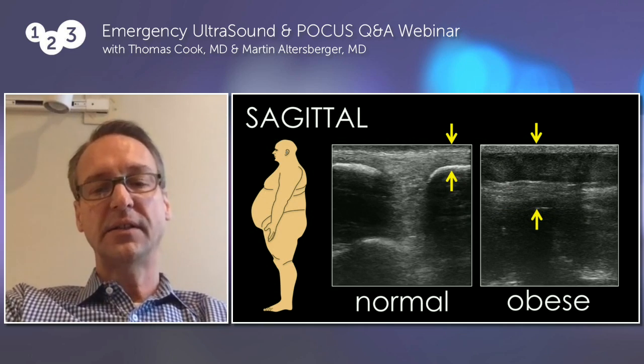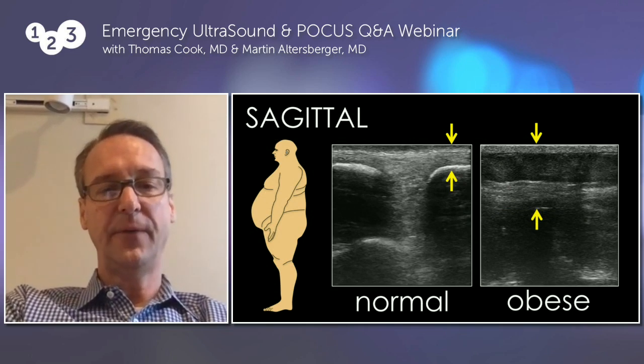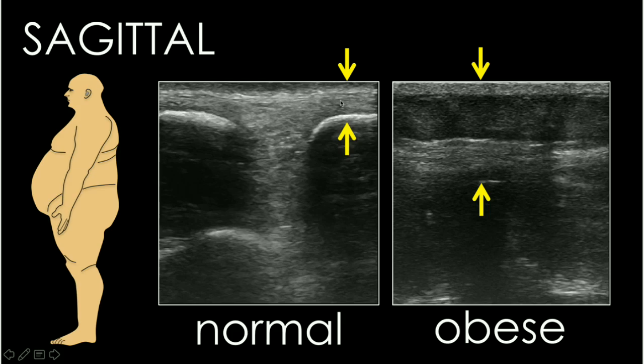If you advance a slide, here you see an example of how different it is when you have somebody who is obese. On the left, you have a normal sized patient. So that's probably what Martin's back looks like right there. Only less than a centimeter of soft tissue over the tip. If you look on the right, this is an obese patient where now you have quite a bit more soft tissue. The darker area is adipose, so that's fat. Then as you go down, you've got these more hyperechoic structures before you see the actual tip of the spinous process.